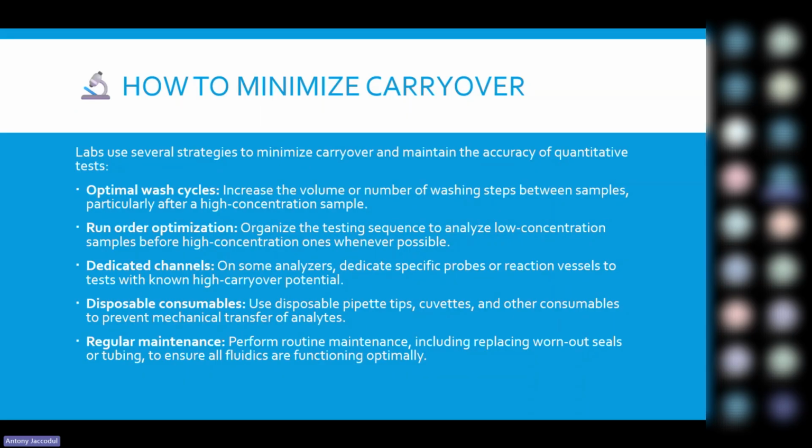And that's why in the ISO 15189 2022 version, if you look at the process requirements chapter of the standard, there's a lot of concentration on ensuring that the data you collect on your lab request is complete and includes patient histories, so that you're able to read and understand that history. When there's potential for carryover from one sample to another, you need to run the samples that are otherwise normal or have low concentrations first, before you introduce the other ones, whenever possible.